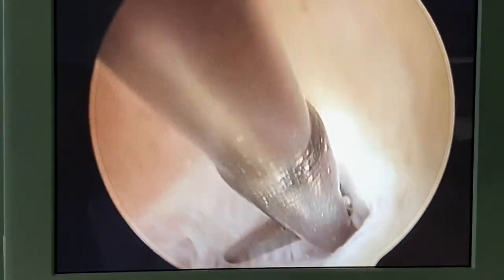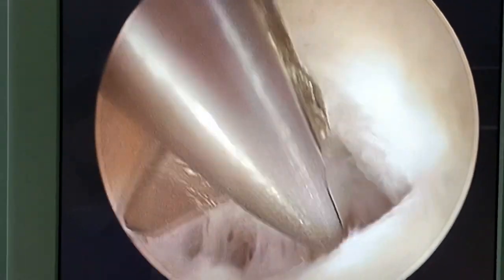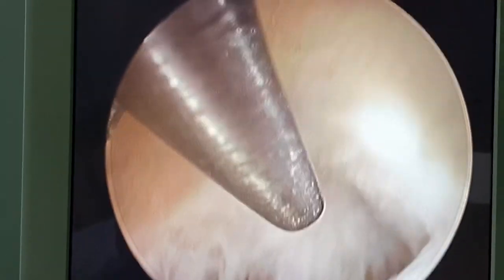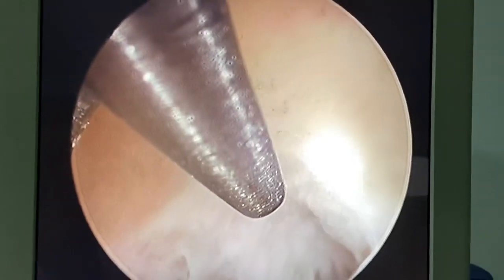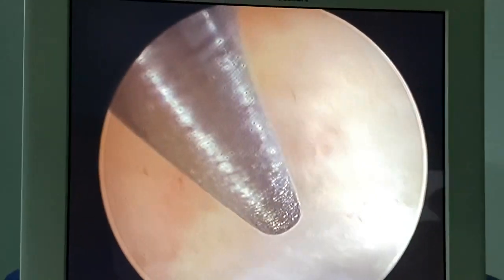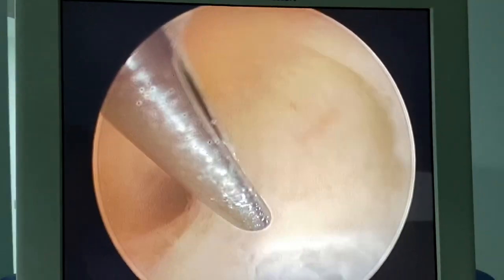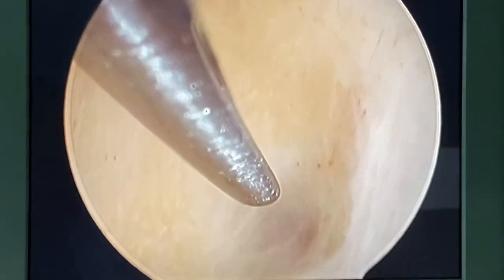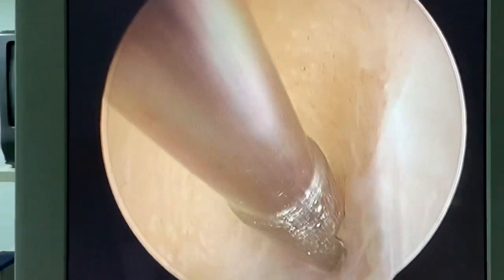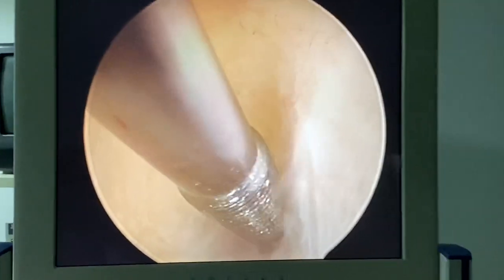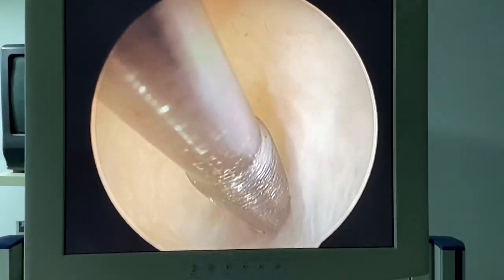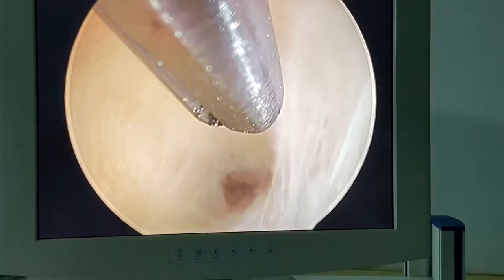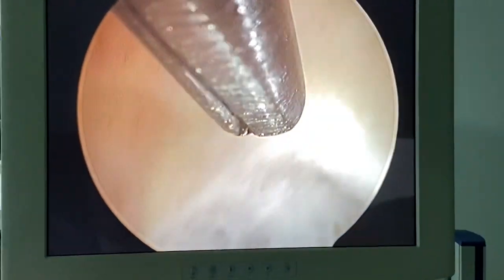This is residual septum — it was not properly done. This is the ostia, and you can work into the ostia like this to do ostial dilation. Remove the membrane. The ostia is looking nicer now.